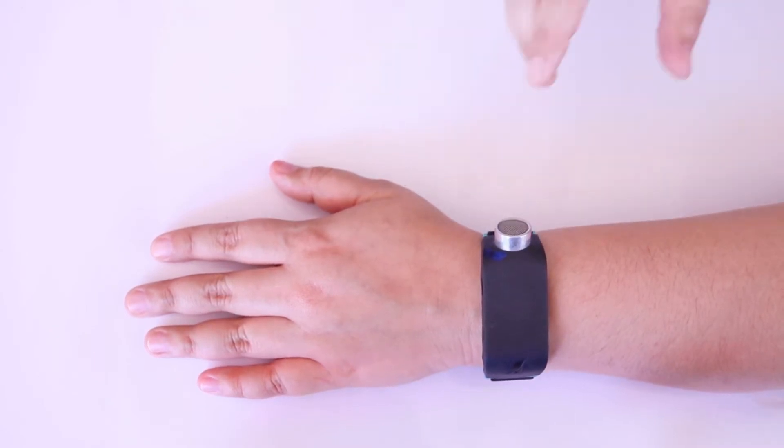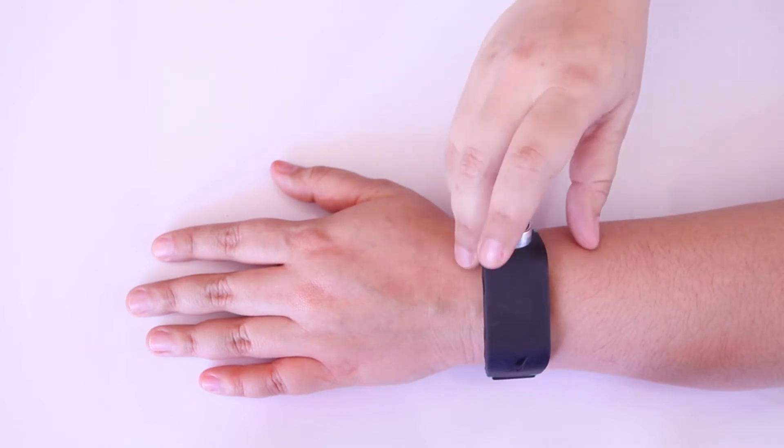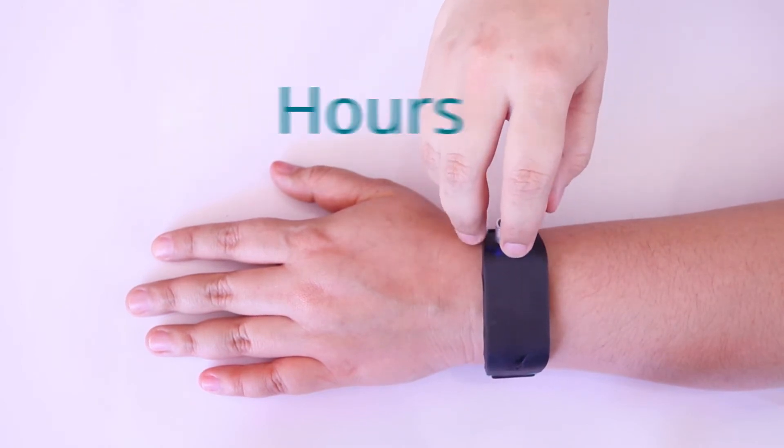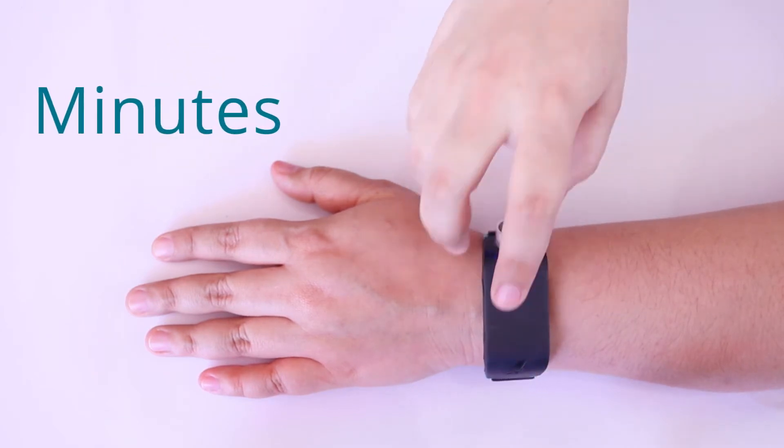To access the Haptic Watch, press the Home button. You will immediately feel a soft short pulse. Then swipe in to read the hours, or swipe out to read the minutes.